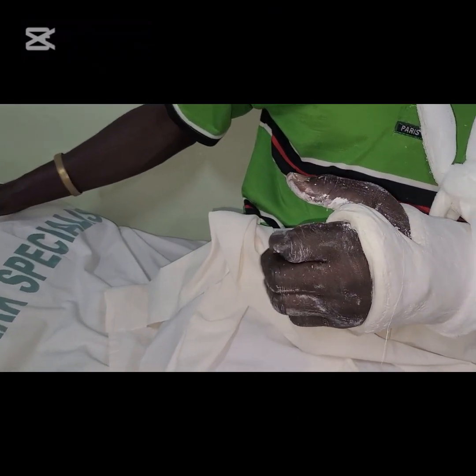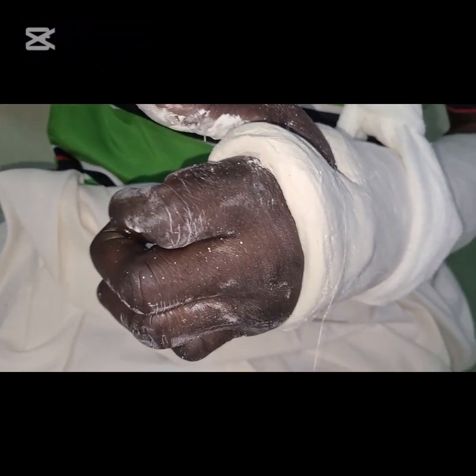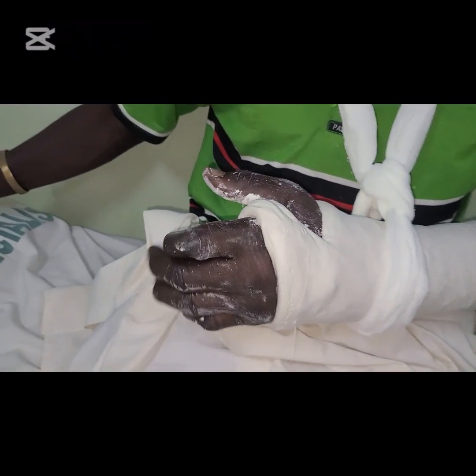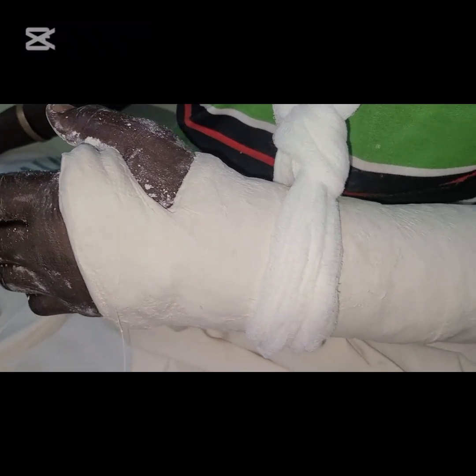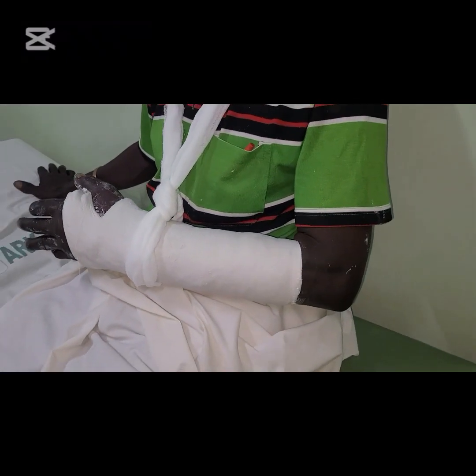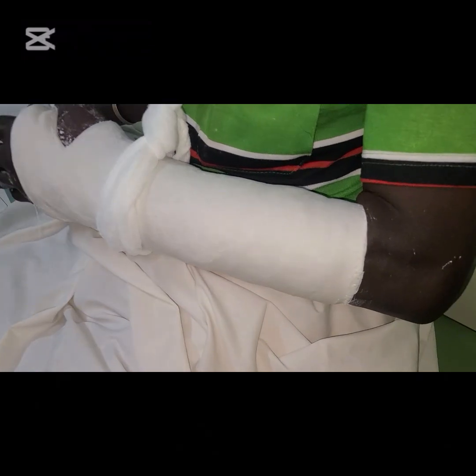This is after we have applied the cast, and we are instructing the patient to move the fingers to make sure that they are free and they are exercising well, because we have to stimulate and maintain that saturation to maintain the functionality of the fingers.